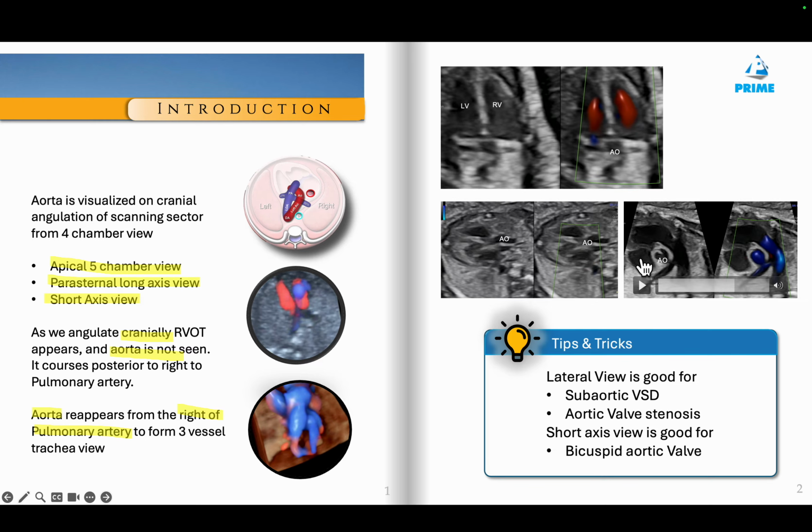So that is the right atrium, if you recognize the structure, because this is not a commonly used view in fetal echo, but this is the right atrium, this is the interatrial septum, tricuspid valve, this is the right ventricle, and this is the right ventricular outflow tract, this is the pulmonary valve, pulmonary artery. The artery which is going behind the aorta is the right pulmonary artery, and this one is the left pulmonary artery, and the ductus arteriosus.